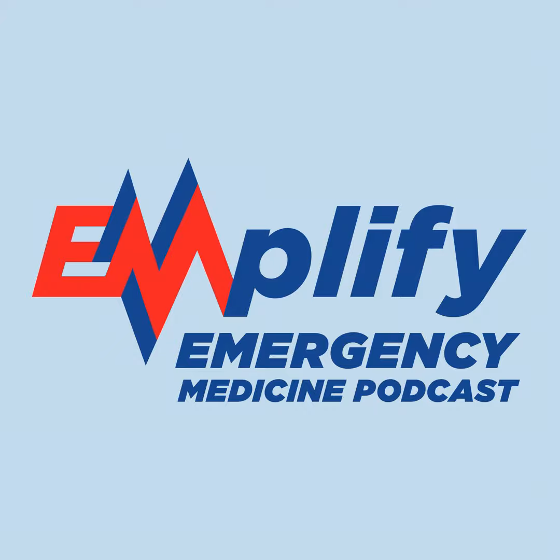So let's shift gears a little bit and talk about our acute respiratory distress syndrome or ARDS patients. Now, drawing the distinction for right now between the standard ARDS and the coronavirus or COVID-19 associated lung disease. For our standard ARDS patient, how are we needing to change our vent settings compared to the previous populations we just talked about? Start is still going to be tidal volume 6 milliliters per kilogram of predicted body weight. Your respiratory rate is going to be what is necessary based on your patient. If they have a metabolic acidosis, maybe they'll be slightly higher. If they don't, maybe it'll be closer to a normal respiratory rate.